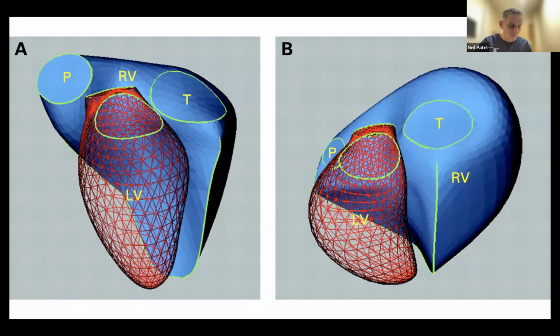So for example, the way that we calculate fractional shortening or ejection fraction using an M mode through a cross-section of the left ventricle is really only looking at one very specific point and one very specific direction of change in chamber size and myocardial thickness. The same goes for tissue Doppler. That's only looking at a small part of the myocardium in the basal region. Same goes for TAPSE. That's only looking at the displacement of one part of the ventricle in a 2D plane.